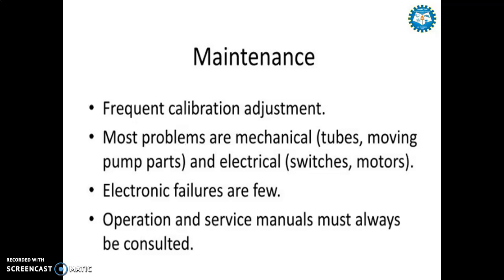Maintenance requires frequent calibration adjustment. Most problems are mechanical: tubes, moving pump parts, and electrical switches and motors. Electronic failures are few. The operation and service manual must always be consulted.